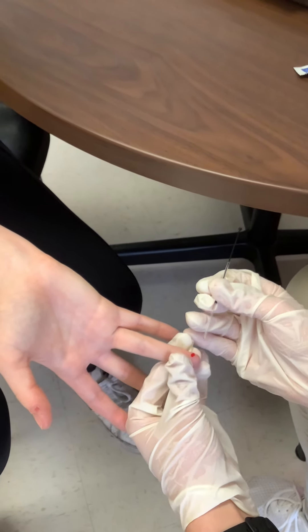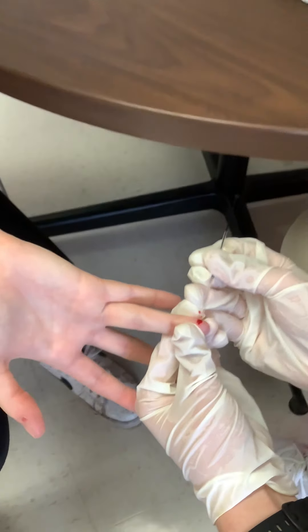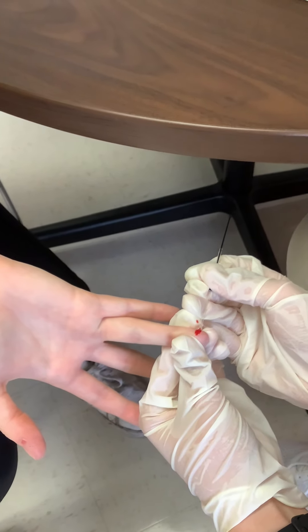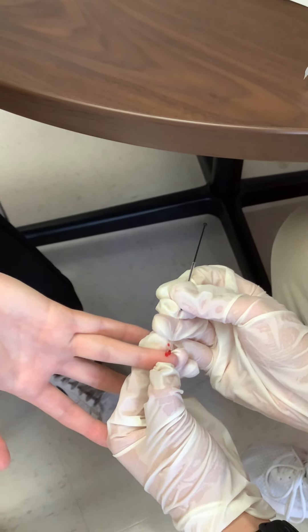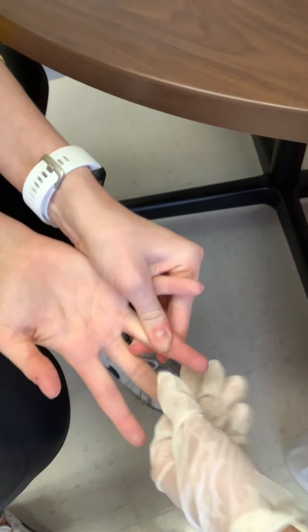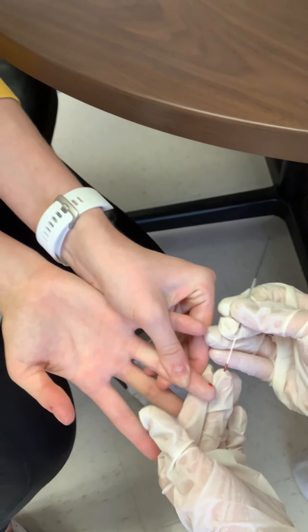Sometimes you may need to redo this. Keep squeezing and use gravity to your advantage. Go in at an angle. Sometimes it's good to wipe away and then just get a full drop of blood instead. Sometimes have the participant help squeeze to get that good drop of blood.